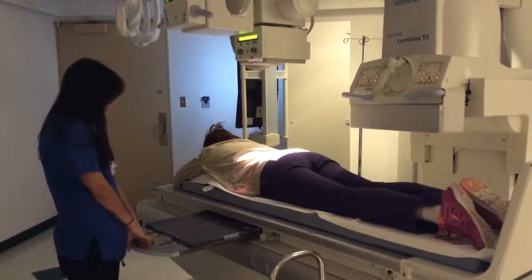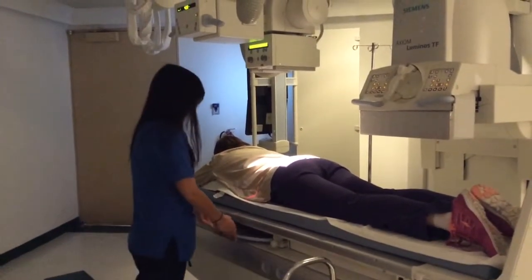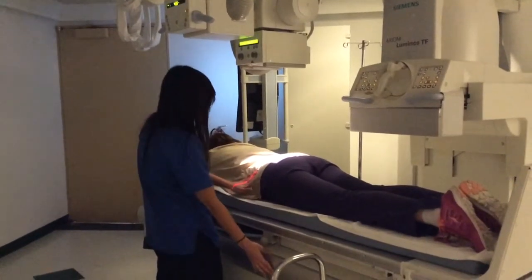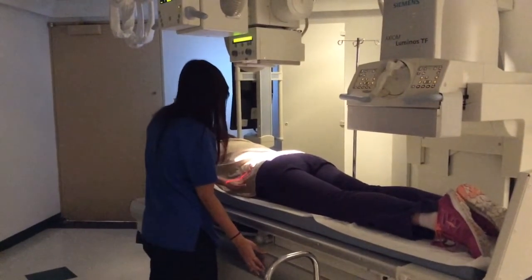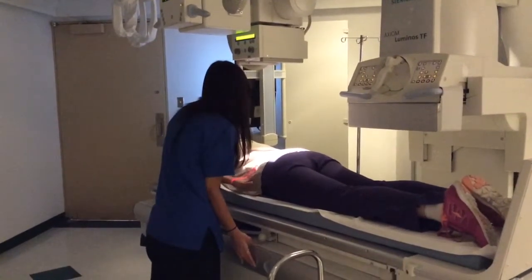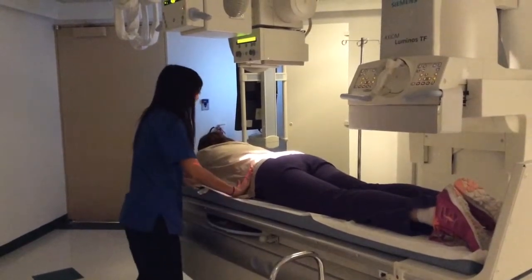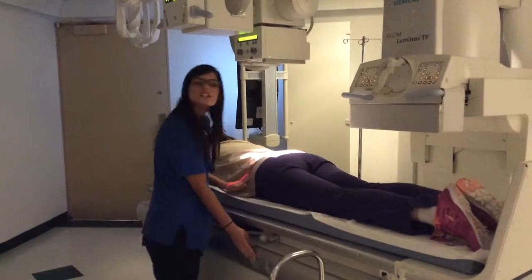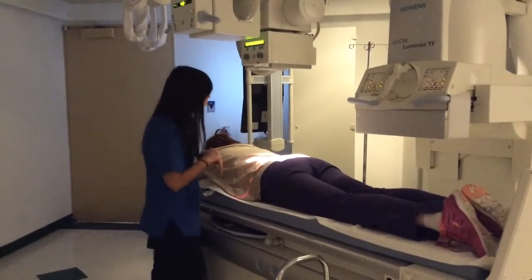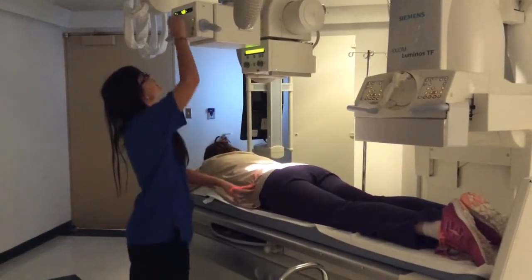I have a 14 by 17 cassette in here with a left marker on the left side. I would center the patient. So the central ray is midline, just above the iliac crest, because for this projection we want to make sure to include all of the stomach. 40-inch SID.